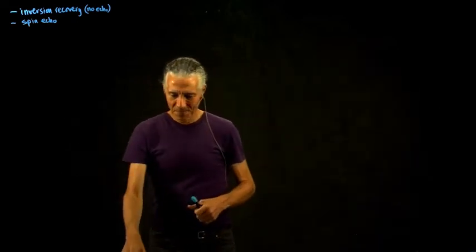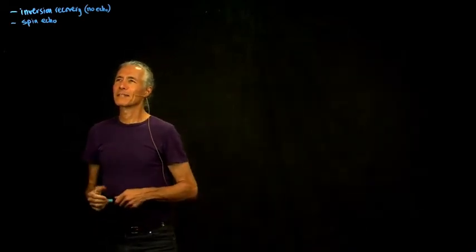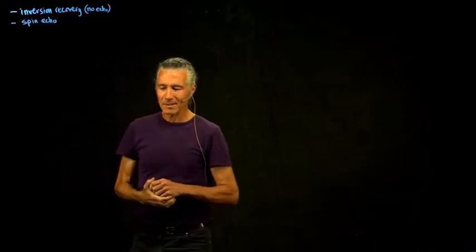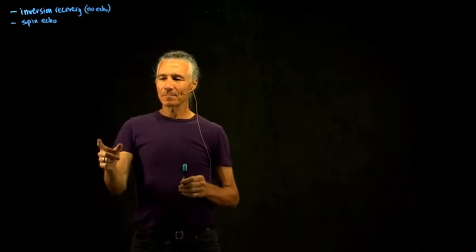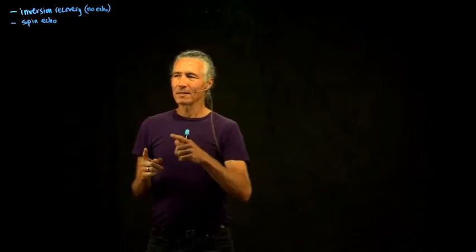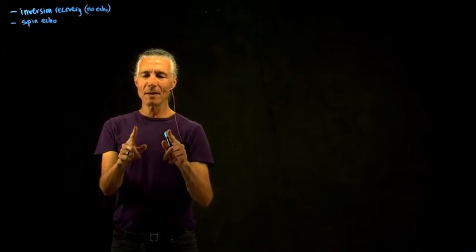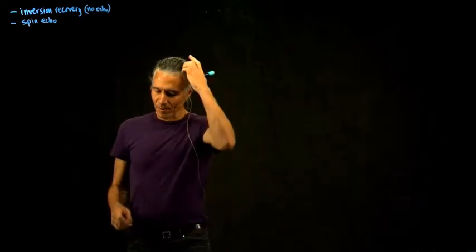Okay, so for today, we want two topics. The first topic is, what do we do on Monday? On Monday we just did the absolute simplest possible thing, which is just do a 90-degree RF pulse on an even grid, so that you define the idea of TR, time of repetition. So you just repeat a 90-degree pulse at a regular interval.